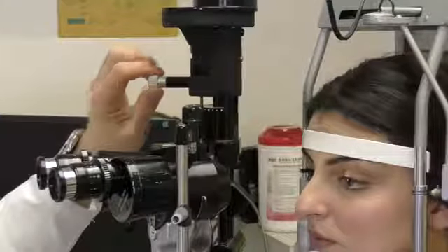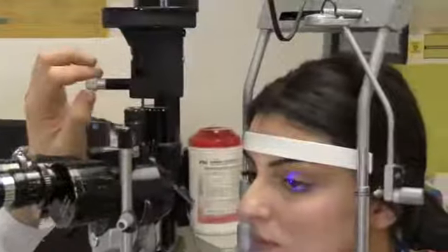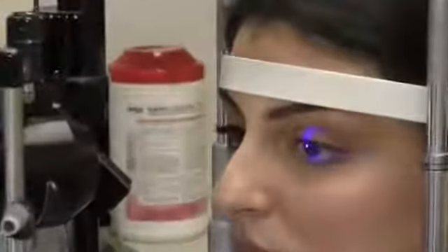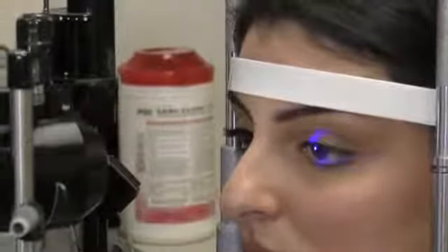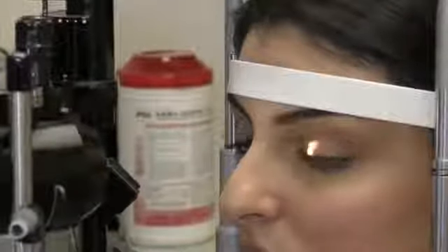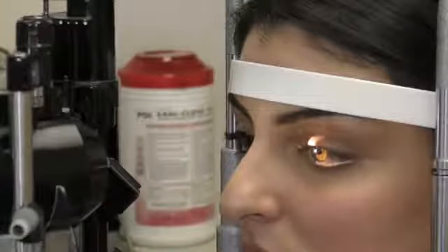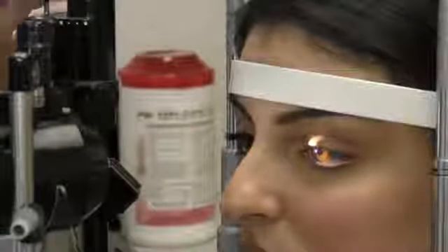If you keep rotating the knob, it'll actually click, and what you can see is that it'll turn the light blue. So if you focus on our eye now, you can see now I'm on the blue filter, okay? If I turn it the other way, watch the beam become shorter and higher, okay? So very important to keep that in mind, okay? When you're doing your exam.